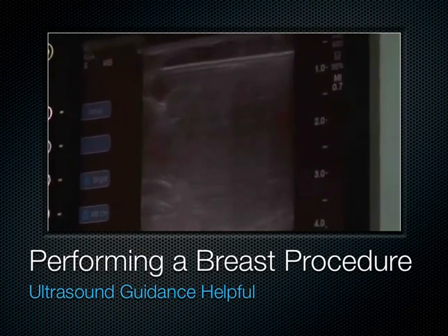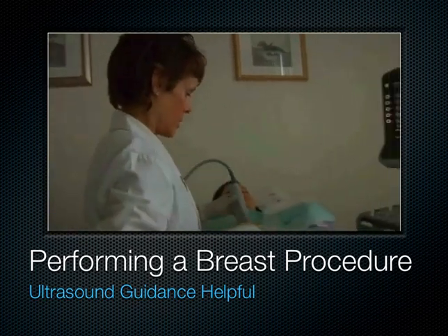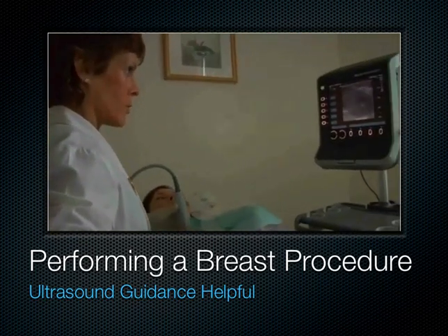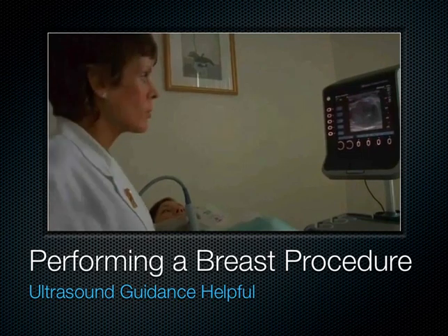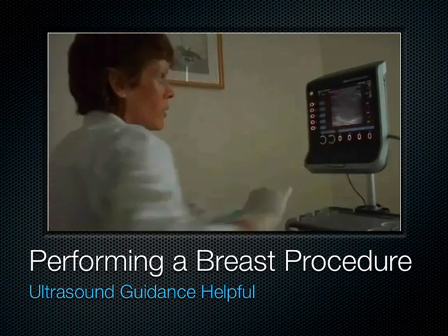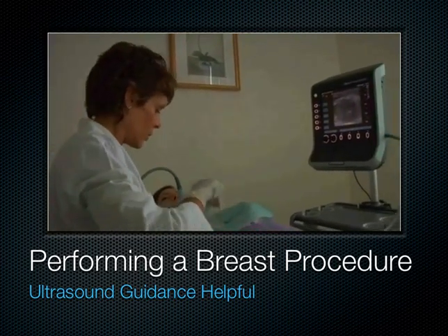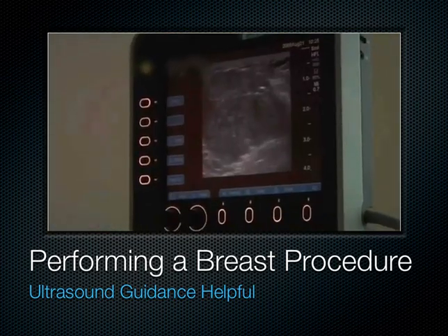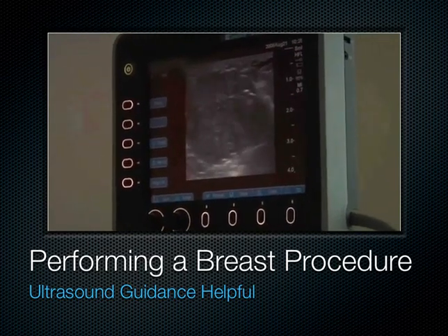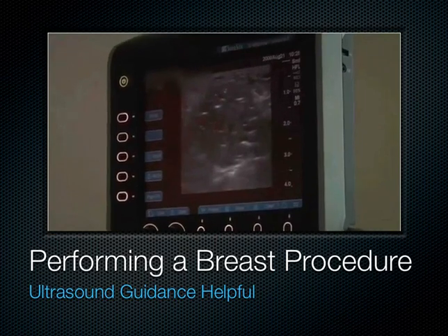And then the last thing I'm going to do is put some numbing actually underneath it, because it's not only close to the skin, but this line down here is her pectoralis muscle underneath. So sometimes as that ice freezes, it kind of gets real cold on the pec. So I'll put some numbing down, kind of get it below. So you probably will feel this a little bit more.